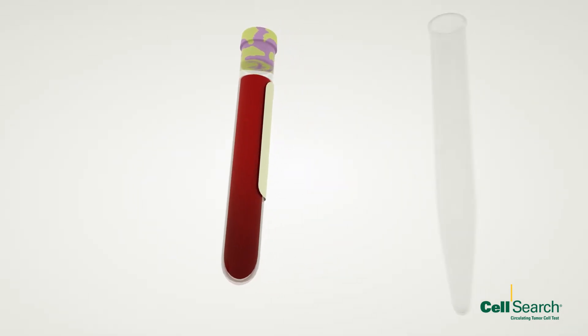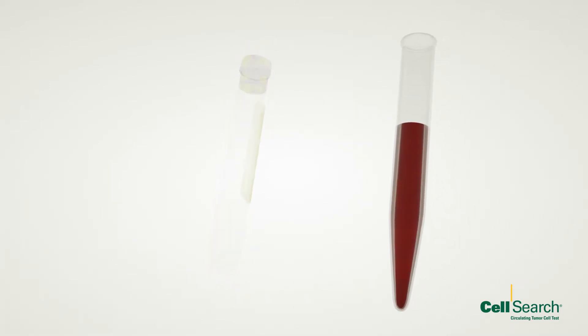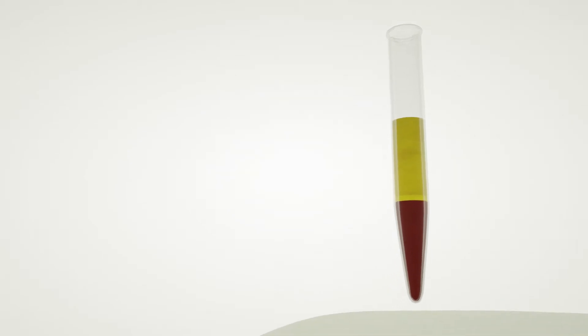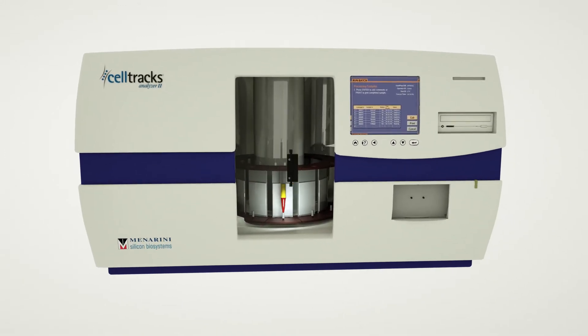7.5 milliliters of blood is transferred into a conical tube and centrifuged to separate packed cells from plasma. The sample is then placed on the CellTracks AutoPrep system, which fully automates the remaining sample preparation steps.